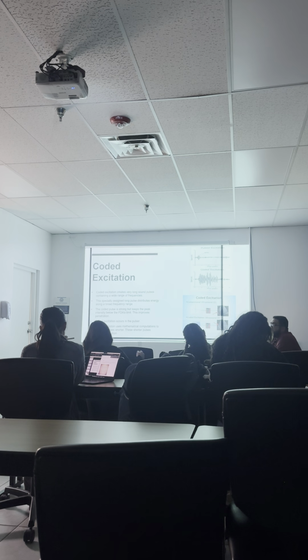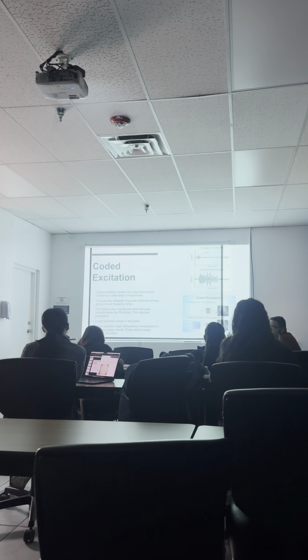Okay, so coded excitation uses mathematical computations to make the pulses shorter. These shorter pulses improve resolution. Does that make sense? You're shaking your head, Emily. Why does it make sense to you? Does it make sense to you guys?